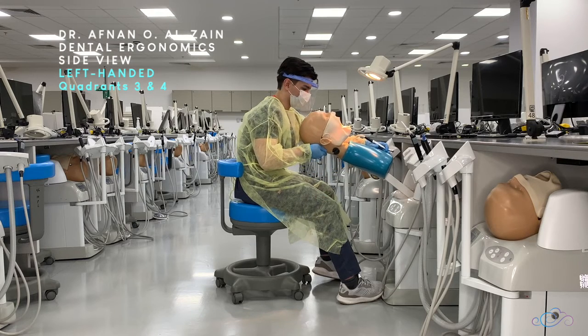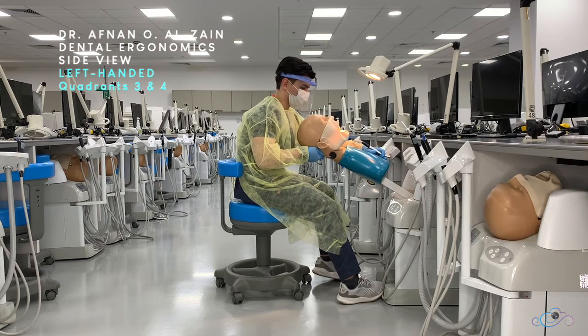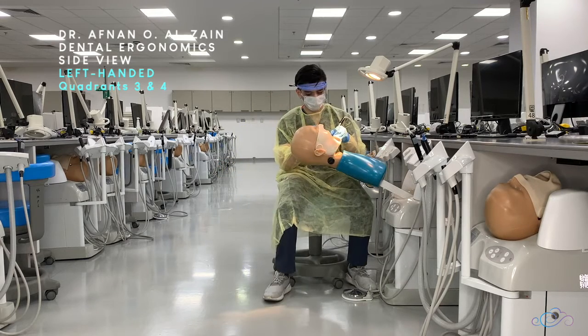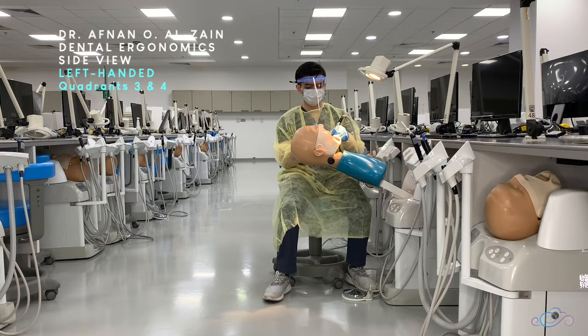Moving on to the lower quadrants three and four, you're going to place the patient at 45 degrees so the occlusal surface is 45 degrees with the floor. When working on the lower quadrants, the dentist position is either on the left rear, left, or frontal position — whatever is more comfortable for you and allows you to see clearly. Don't forget to adjust the light to direct it towards the operative field.